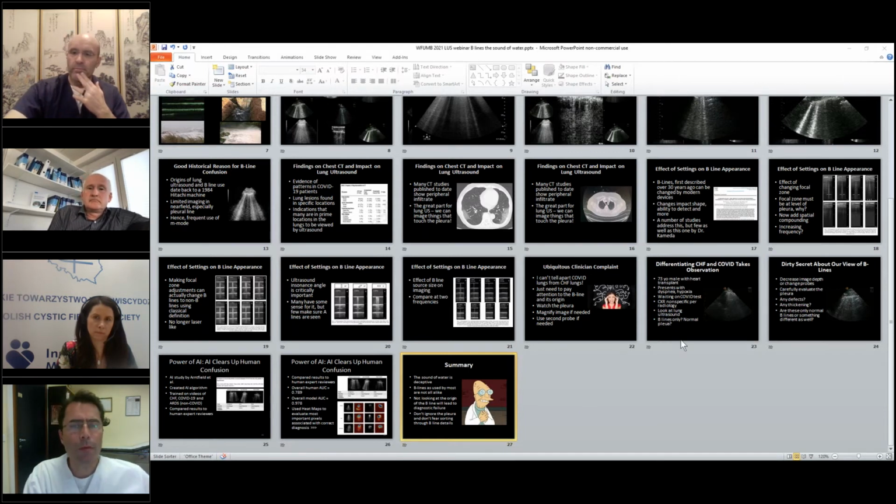Yes. Christoph, do you want to comment on the scores, or do you use them, or you don't? As you might have seen or not seen in my presentation, it's yes or no. I can't count above 3, and there are no scores. So I see a consolidation, I see pleural irregularity, I see B lines, and if it fits together, it's very indicative of COVID in a pretest probability setting.